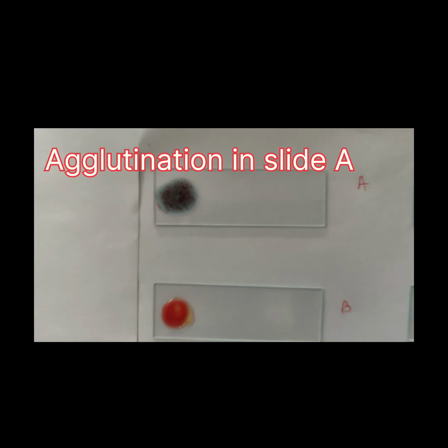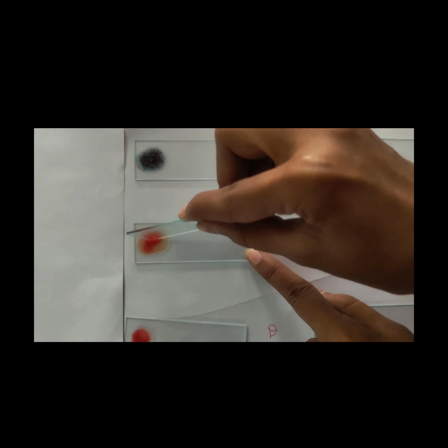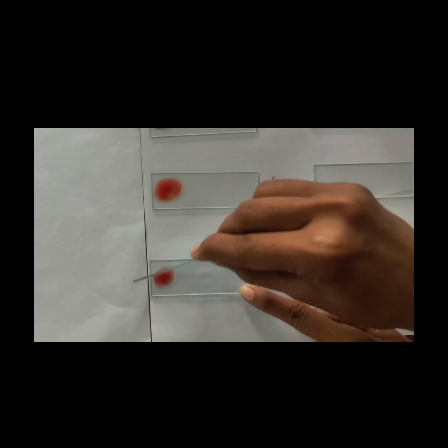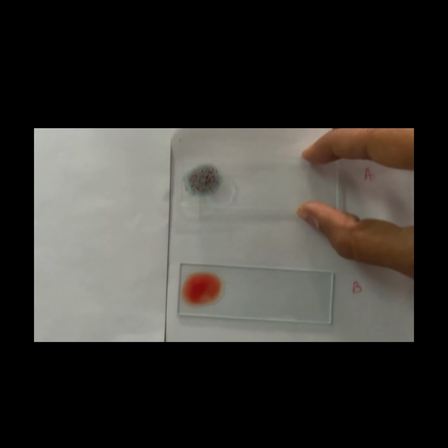So there is agglutination in slide A. We can clearly see the agglutinated RBCs. There is no agglutination in slide B. And there is agglutination in slide D. So the blood group is A positive.